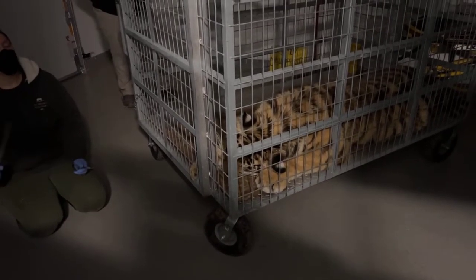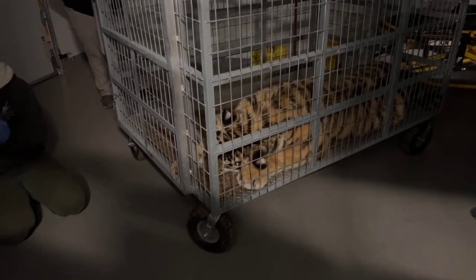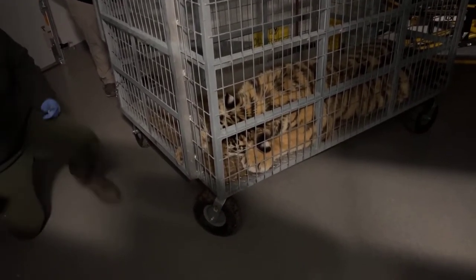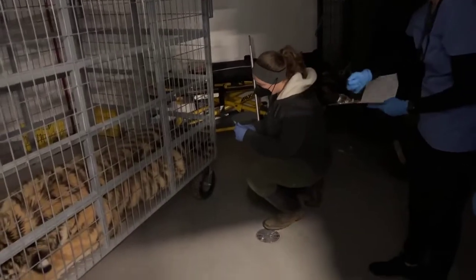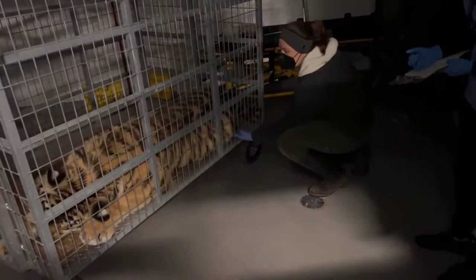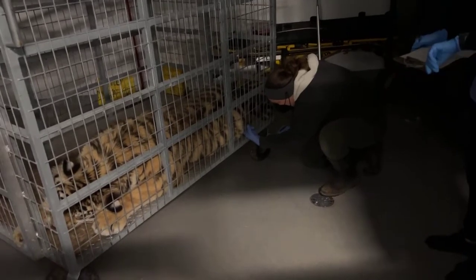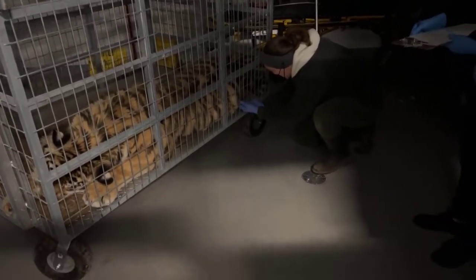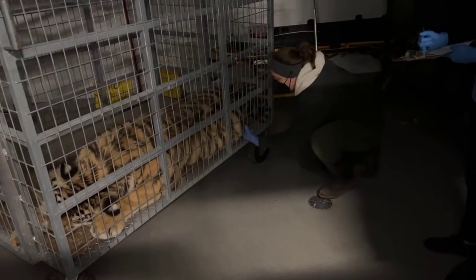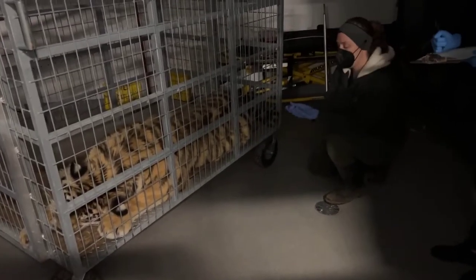So this is when the vet team decides if we're going to just wait the full 15 minutes or if we'll give him a bump, which means a little bit more medication to make sure there's no reflexes. So he'll be receiving a hand injection of just a little more of his immobilization cocktail. And part of that was when Elise gave the injection, she looked at it and a little of it hadn't dispensed from the syringe, so we know it's safe to give this little bump.